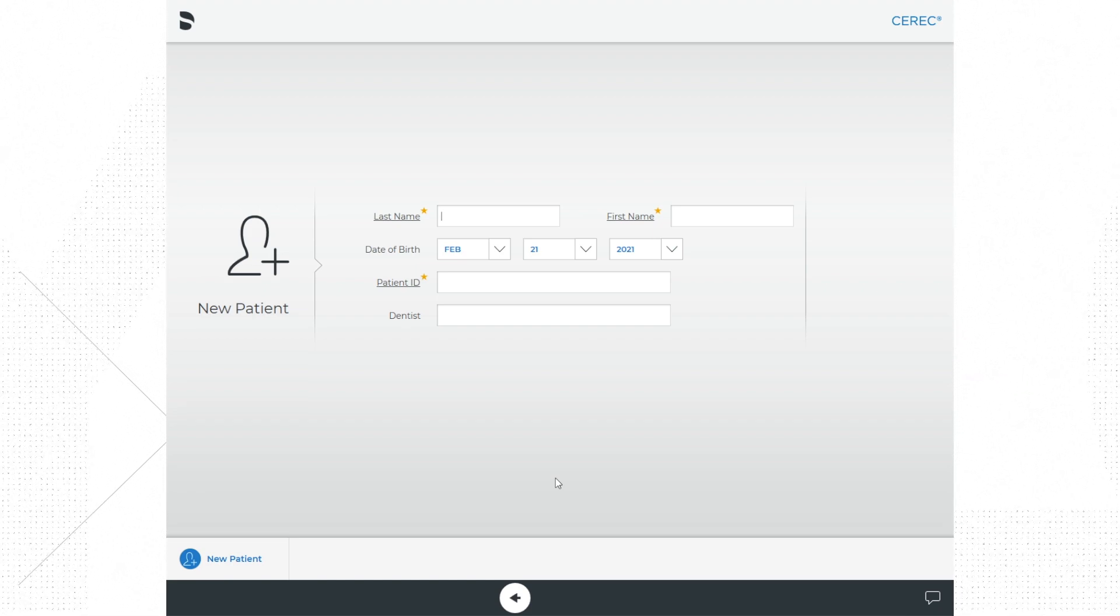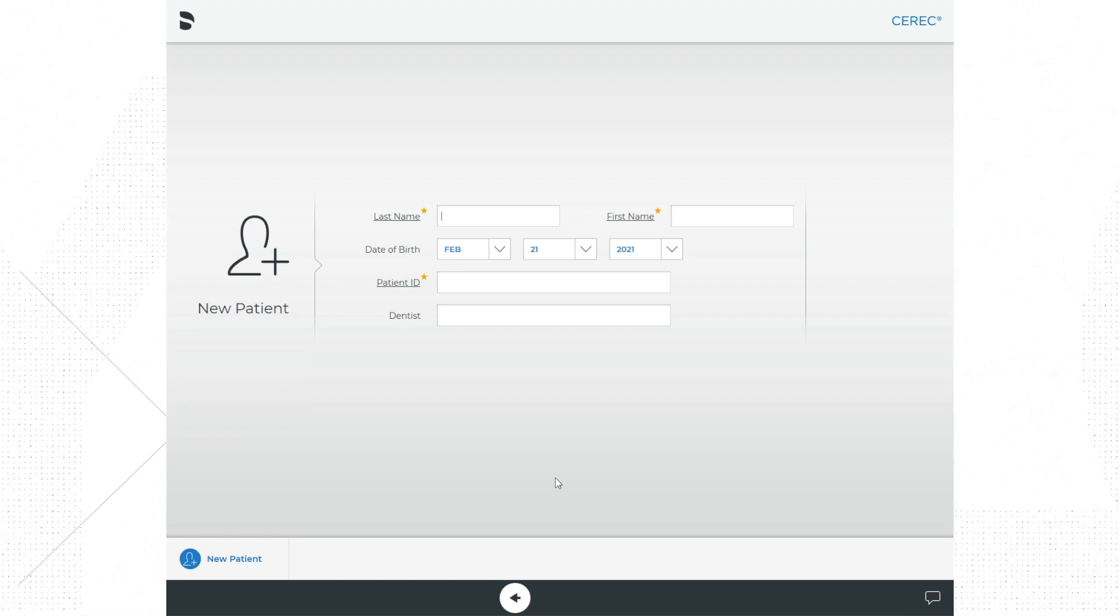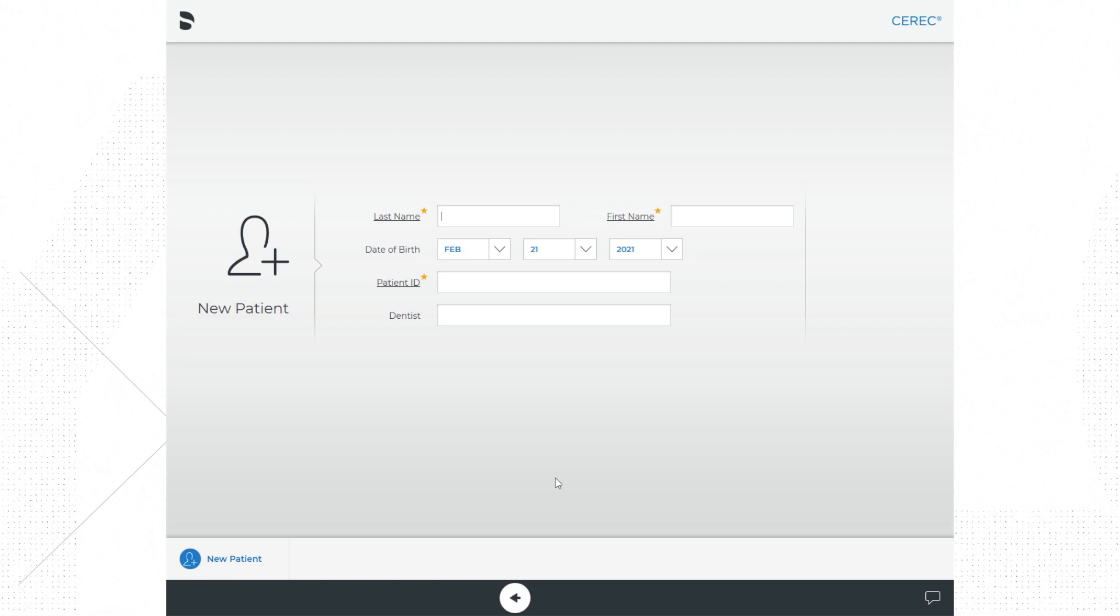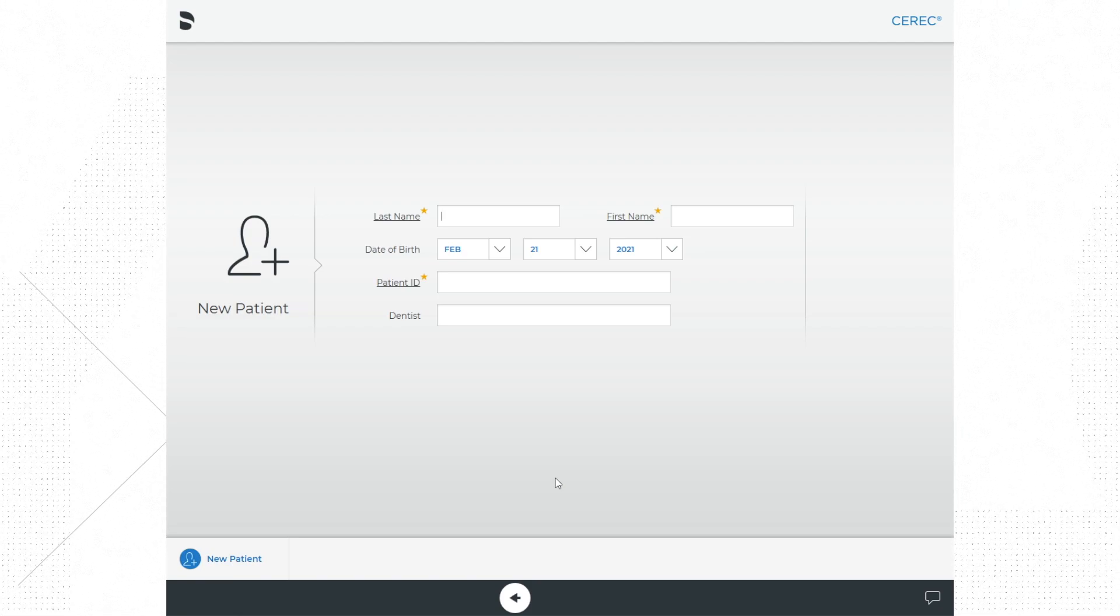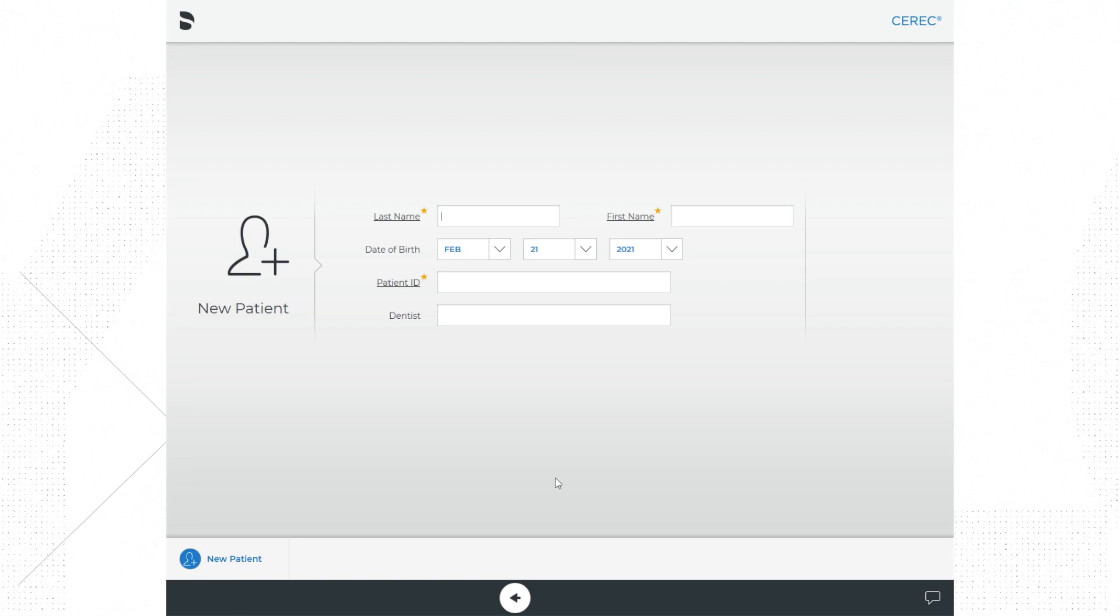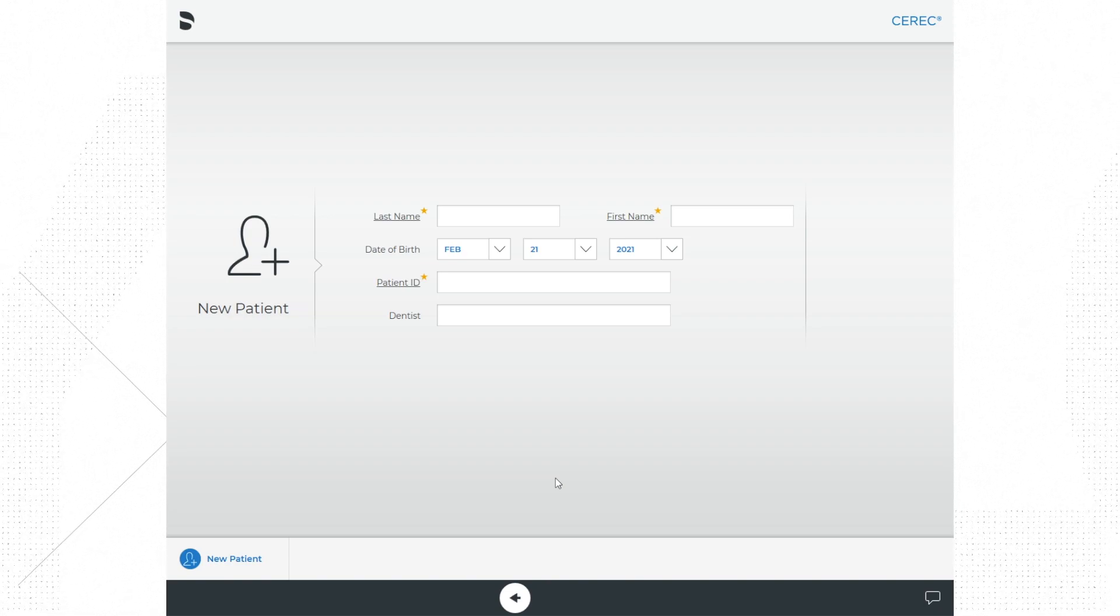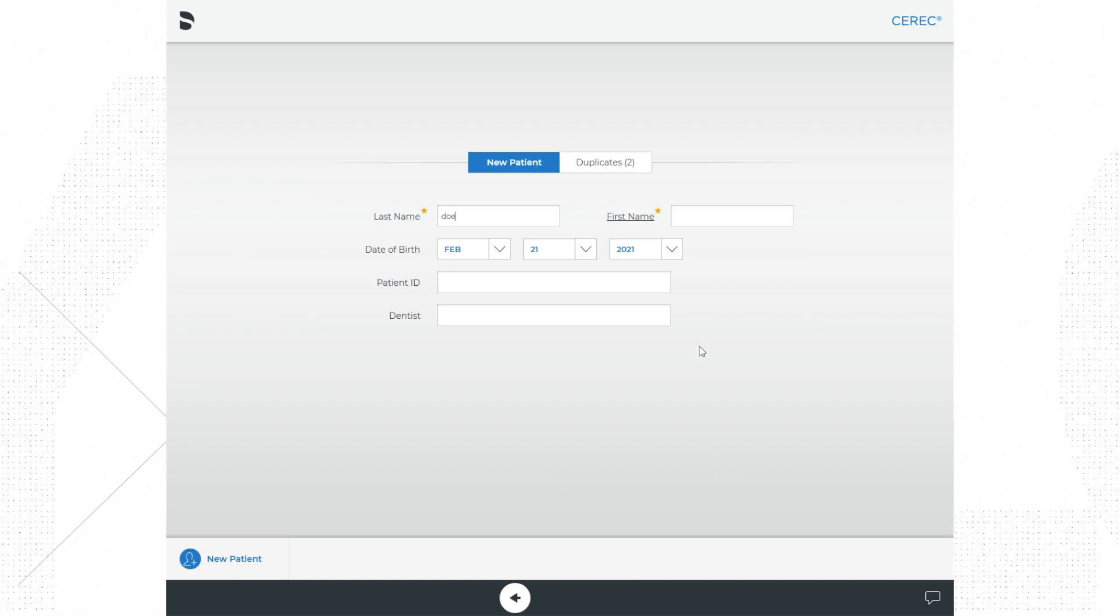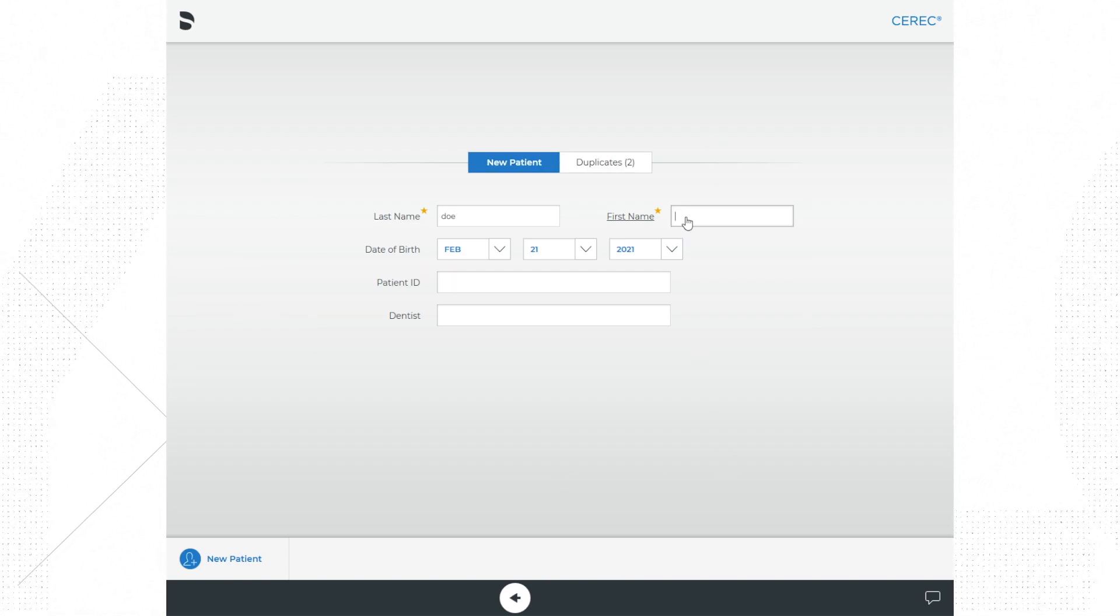For dentist, add your last name as the treating provider. So for this exercise as we go through the software, we are going to scan some models. For this section we will make some things up for our mock patient.